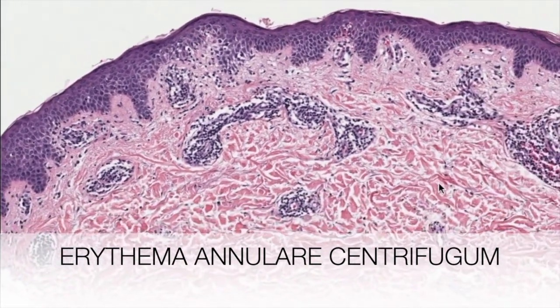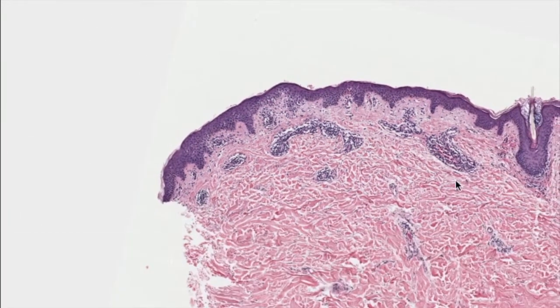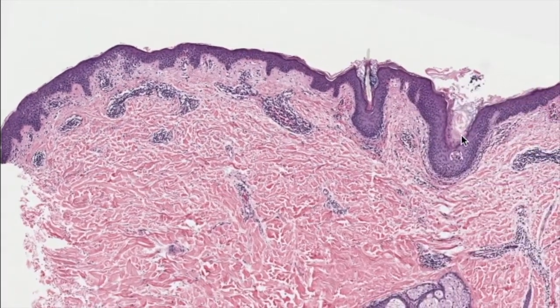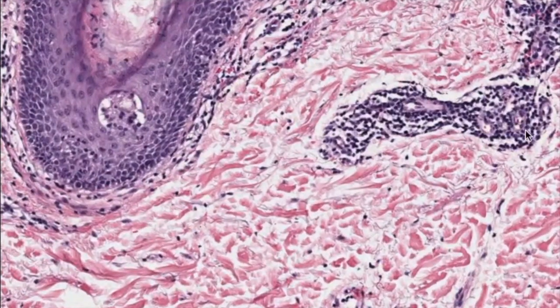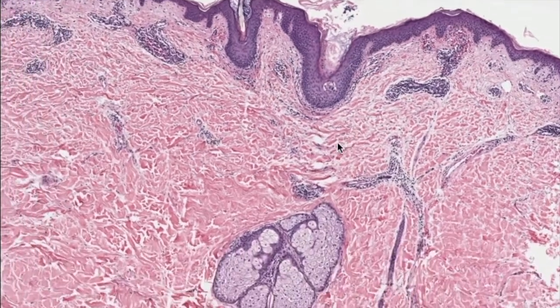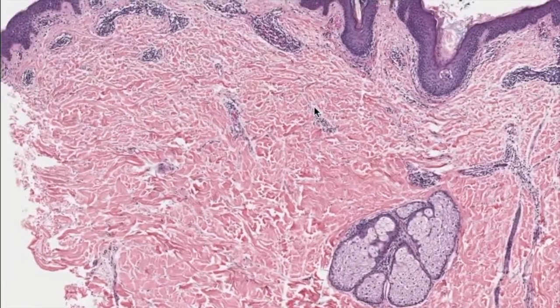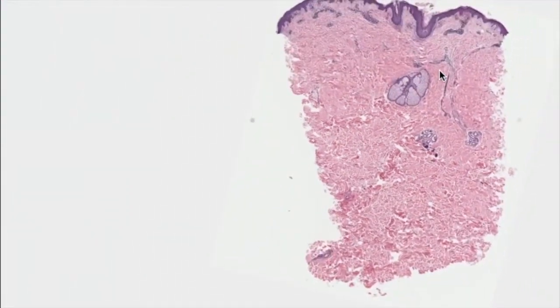The pattern of the vessels, they appear like a coat sleeve, and the perivascular inflammation type of vasculitis, you see lymphocytic vasculitis with the spongiosis of the epidermis. This is also another overlap case. Very nice example of Erythema annulare centrifugum. So let's take another example here.